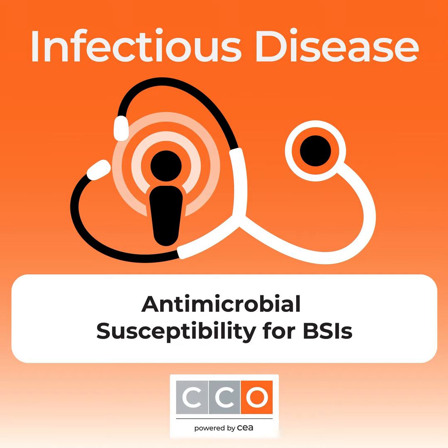Enterobacterales is the most typical gram-negative group that we isolate in the laboratory. E. coli is the most predominant one. Based on the data for our institution, we know E. coli is the main organism. Dividing the Enterobacterales group into E. coli, Klebsiella, and Proteus versus the SPICE-M group makes a lot of sense from the perspective of what we're looking for and what we can do with them.